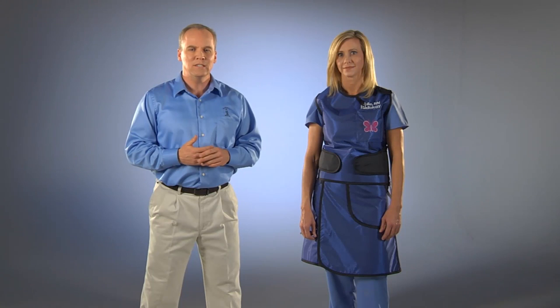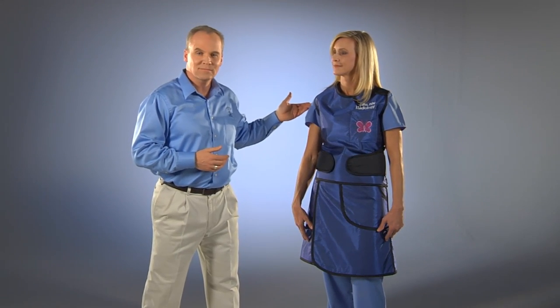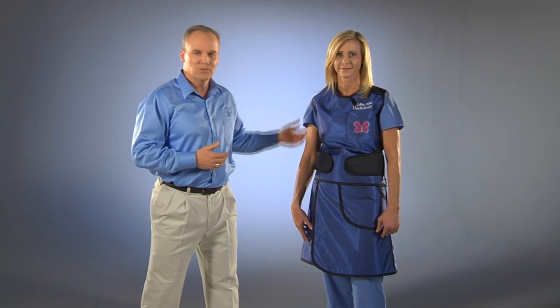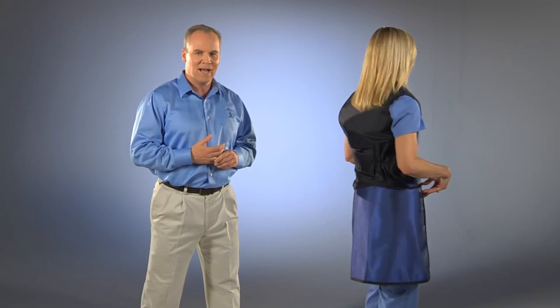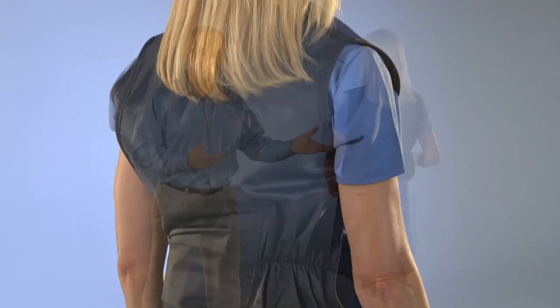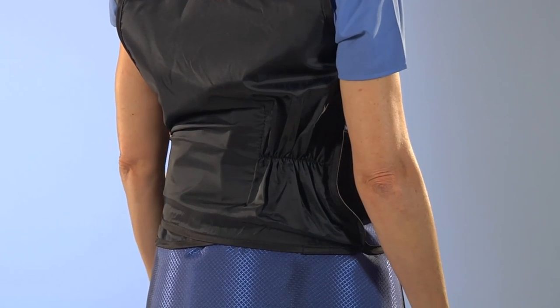All of our aprons are available in gender-specific standard sizes as well. The advantage of the PVK is in weight distribution. Half the weight of the apron is in the kilt portion, relieving that weight from the shoulders. The vest portion of the apron also distributes weight from the shoulders to the hips through the back-saving criss-cross stretched back, reducing fatigue. This design provides lower back support and long-term comfort.